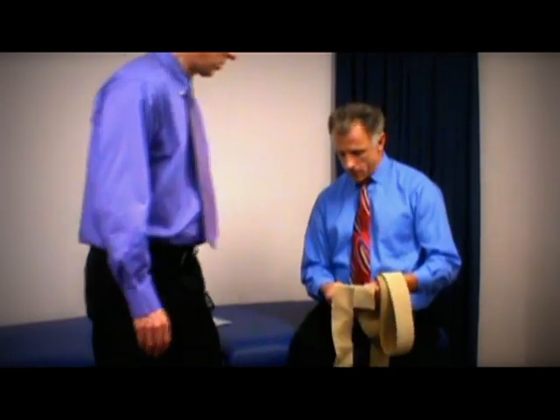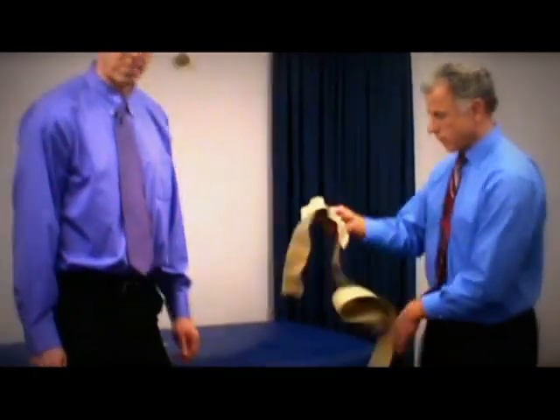So, again, the Rolyan Lower Extremity, I was digressing there, wasn't it? Lower Extremity Tone and Positioning Splint. They call it TAP, Tone and Positioning Splint. Lower leg, Tone and Positioning Splint. And Brad, should I be the patient that generally has it? I took my shoe off already.